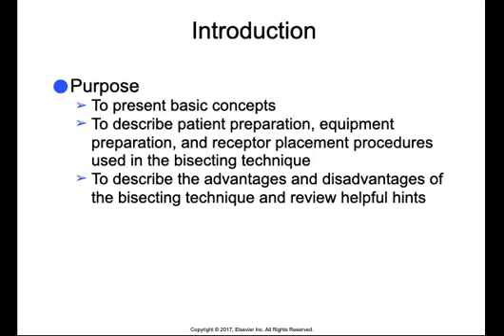Now, the American Academy of Oral and Maxillofacial Radiology recommends the use of a paralleling technique for intraoral exposures because the bisecting technique sometimes can cause errors with angulation and distortion.